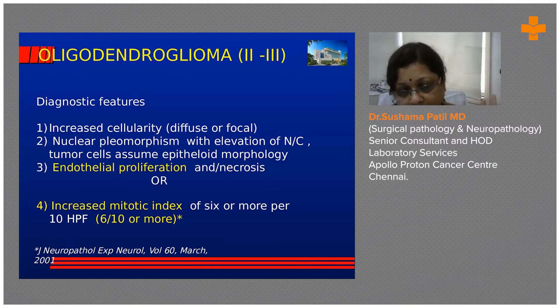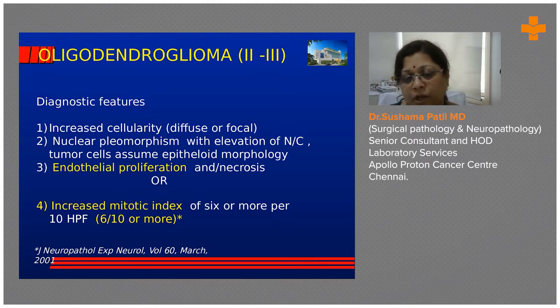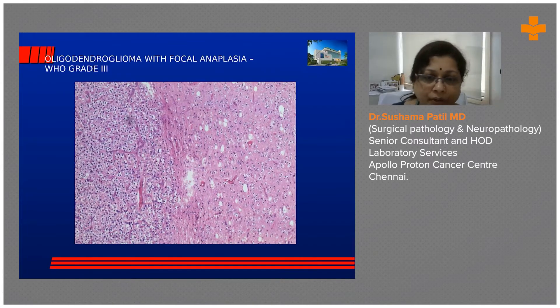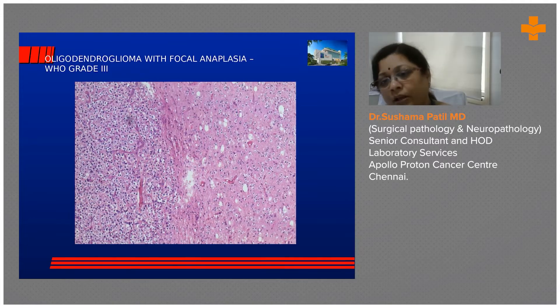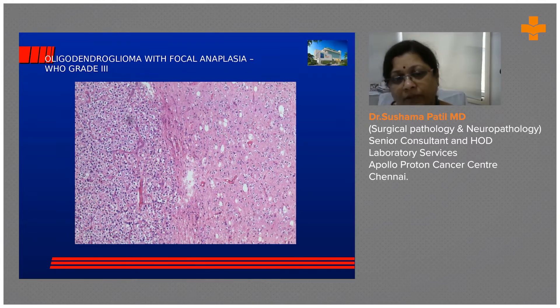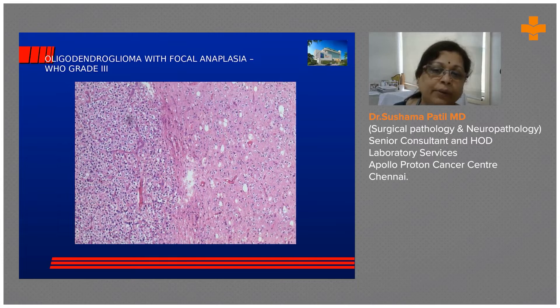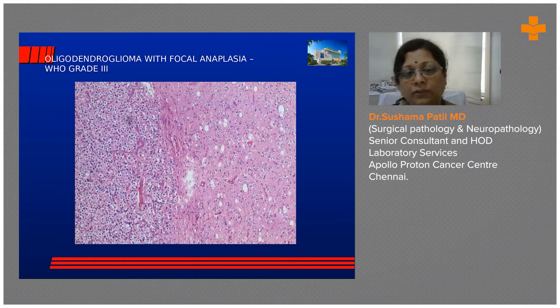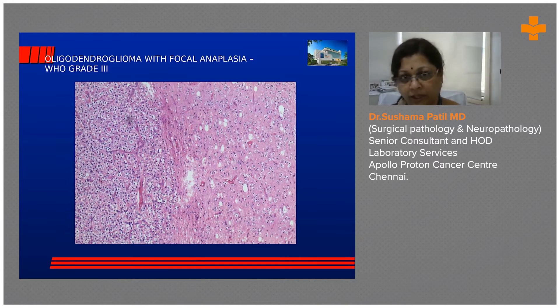These tumors are graded as Grade 2 and Grade 3. For the anaplastic category I look for six or more mitoses; otherwise it falls in Grade 2. On the left-hand panel you can see a stark difference in cellularity — more cells on the left, lower cellularity on the right. Over time, oligos can undergo transformation: nodules of hypercellularity appear where the tumor has taken off and is becoming more aggressive. In such cases I call it an oligodendroglioma with focal anaplasia, still Grade 3, because mitosis in that area counts above six.